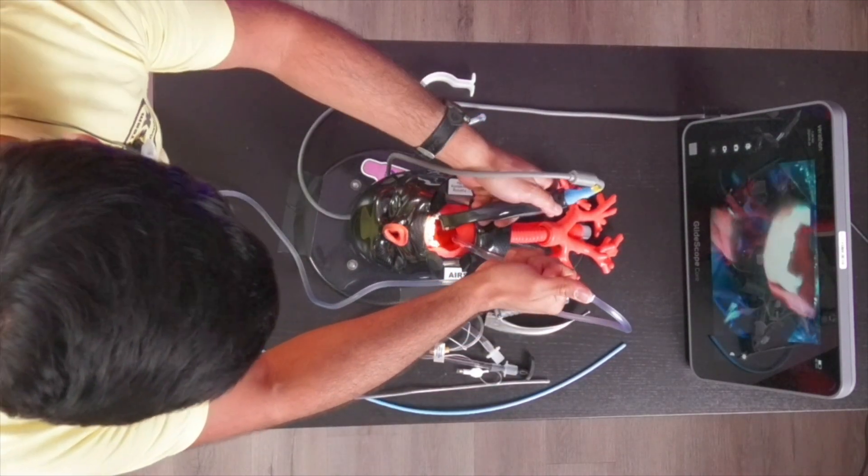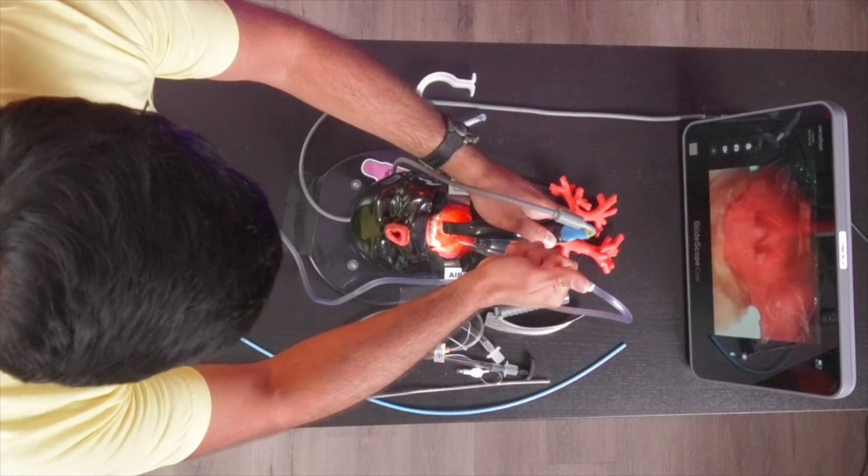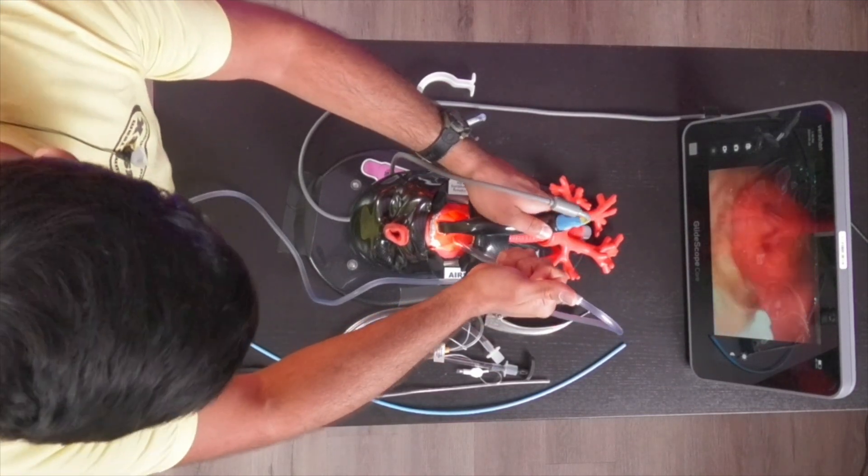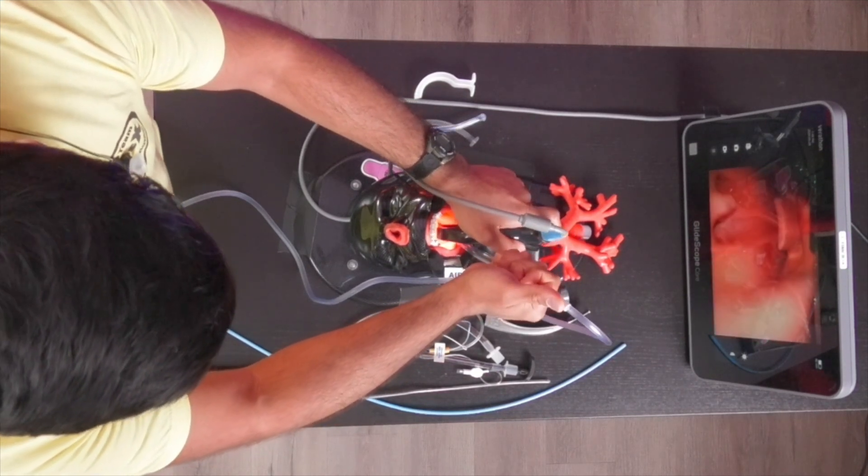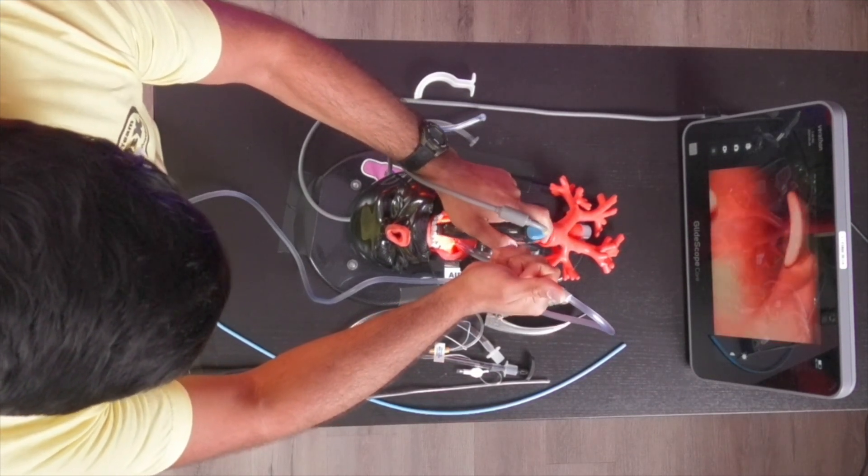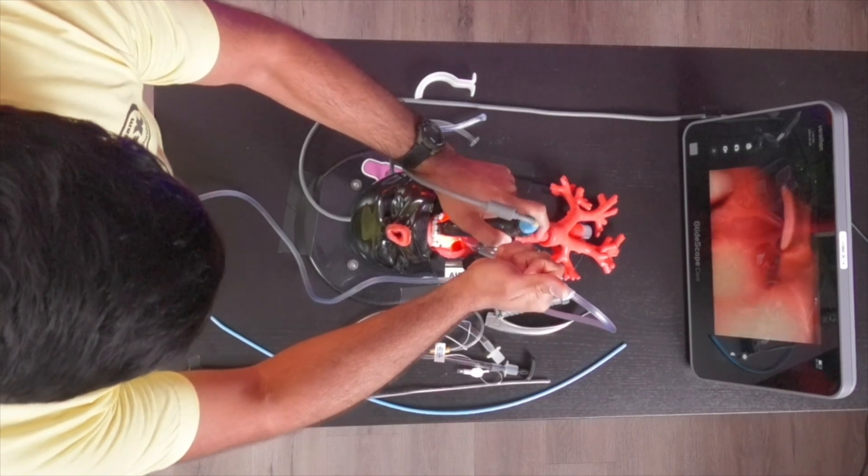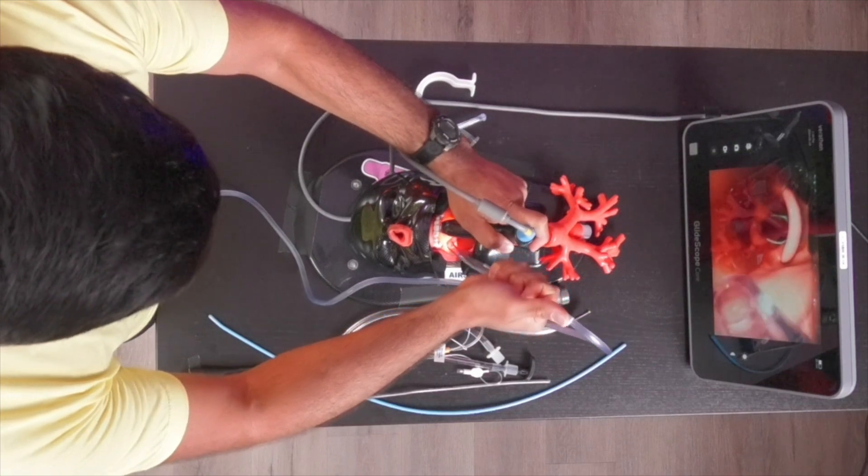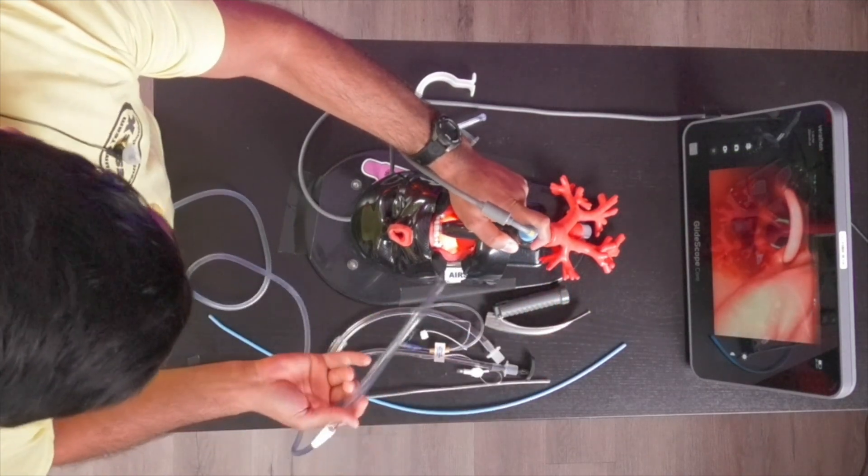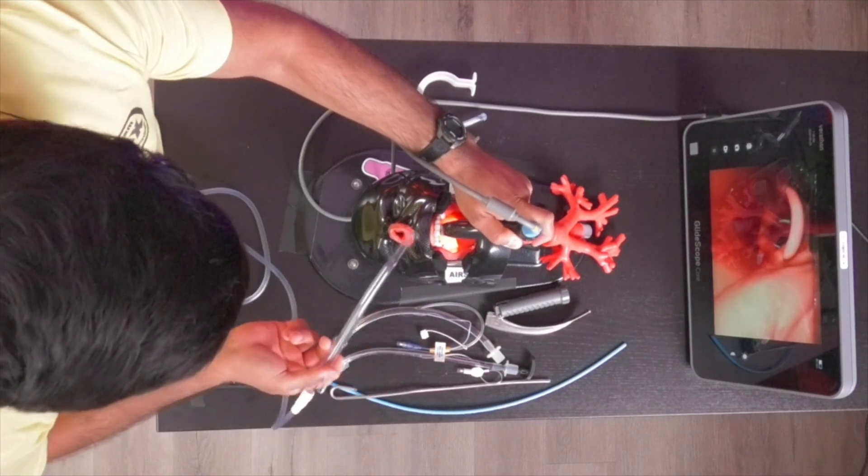Once I've got the suction in, I can then insert my laryngoscope. We're going to now use a technique coined by Dr. George Kovach, another airway guru: the EVLI technique. That's Epiglottoscopy, Valleculoscopy, which is seeing that space above the epiglottis and seating your blade into that, Laryngoscopy—this is the L part—and then followed by Intubation, which is the I.